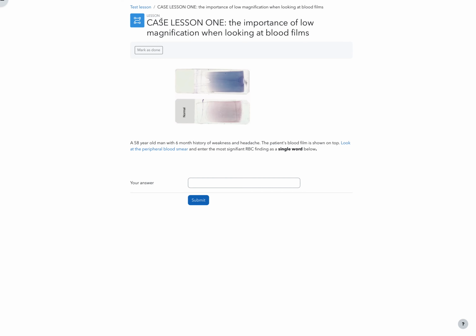Doug Kachuk here to show you what we can do with virtual microscopy and Moodle in teaching hematologists and others how to look at a blood film. In particular, this lesson is about the low magnification approach of blood films, and it's presented as a series of questions which you're graded on.